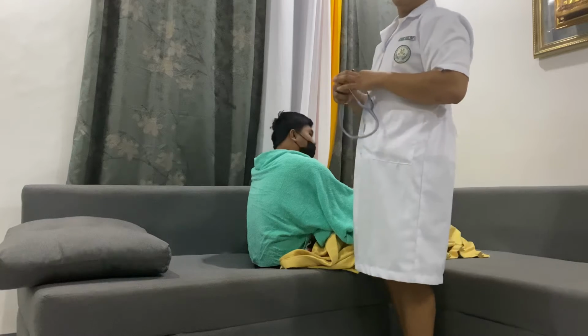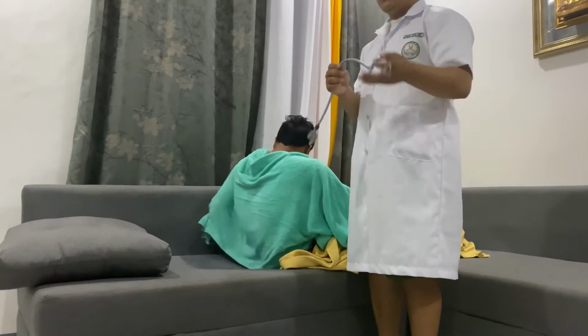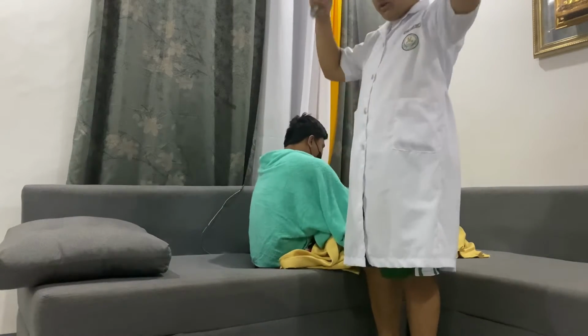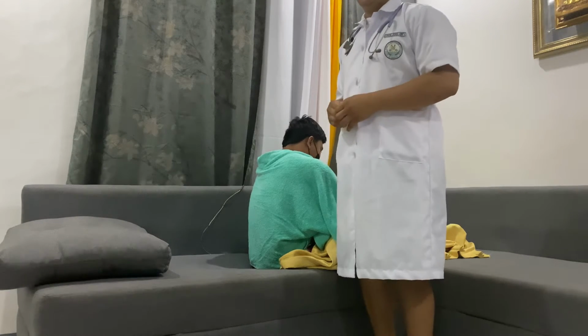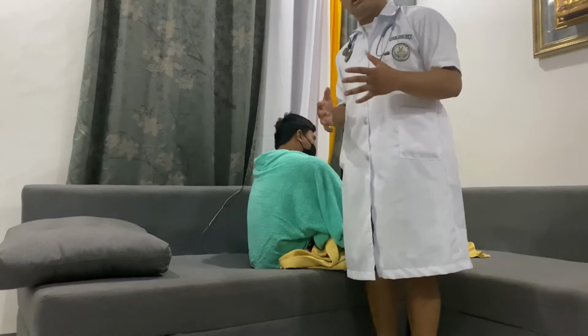So now while auscultating the patient in sitting position, I can also hear the S1 and S2 sound, which is the lub dub. So it is basically normal.